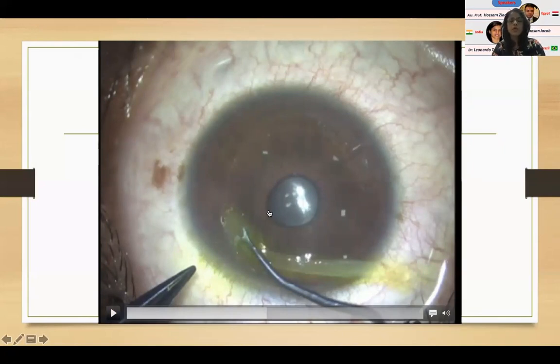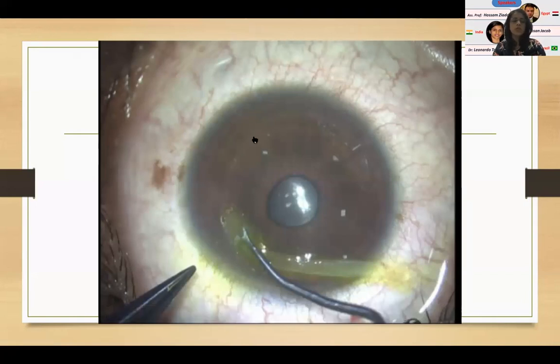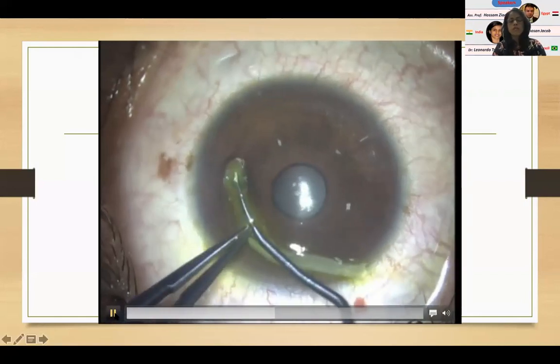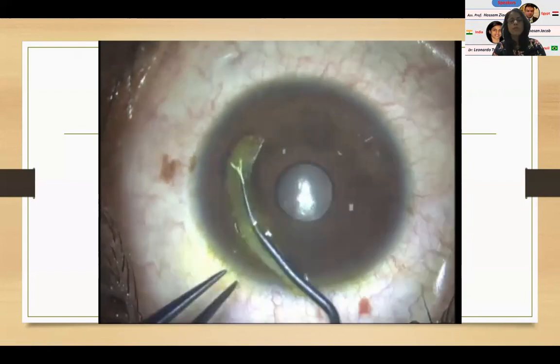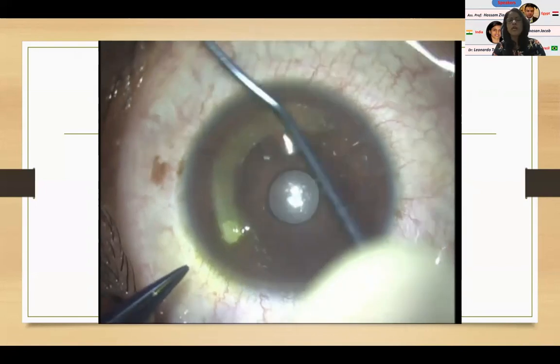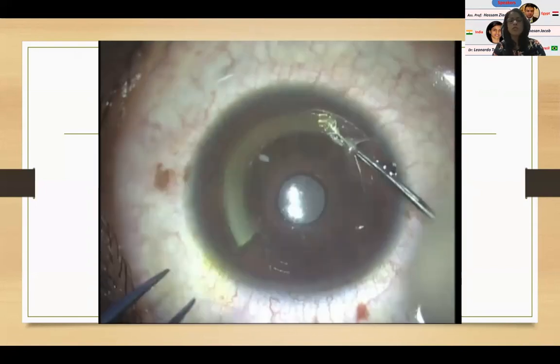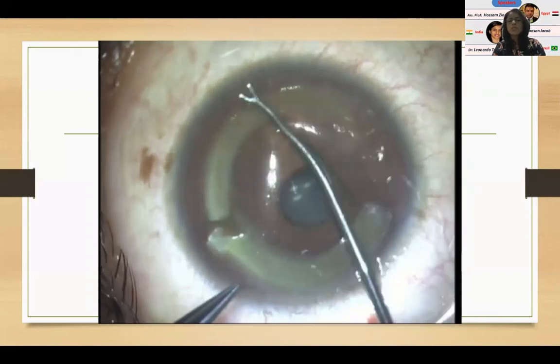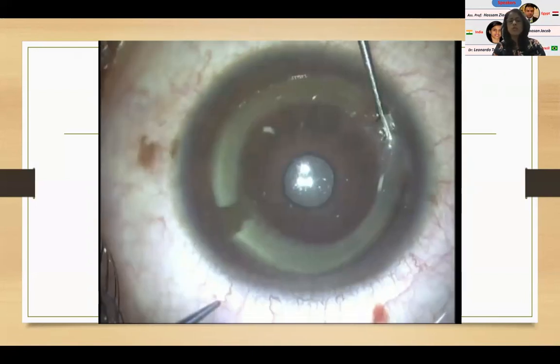And one thing that's always asked of me by people who have seen this technique or who know about it is: is it not difficult to insert these segments, because they're all used to holding the Intacs or the Ferrara ring or Keraring and just pushing it in. But you'll notice that this also goes in very easily, as seen here. So you just have to push it in, then guide it forwards, sliding it forwards using a blunt instrument, trim it to the desired length, and then you can go to the other side and pull it into place. So the same thing is done here on the opposite side. So I've got these two segments in now.